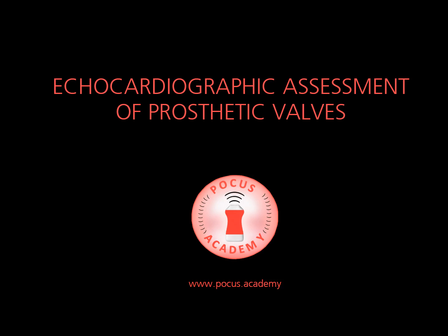Welcome. This session is a practical guide to evaluating prosthetic heart valves using ultrasound, primarily transthoracic and transoesophageal echocardiography with Doppler. We will focus on the questions you need to answer at the bedside. Is the valve opening and closing normally? Are gradients appropriate for the prosthesis and the patient's flow state? And is any regurgitation present, particularly paravalvular leak?